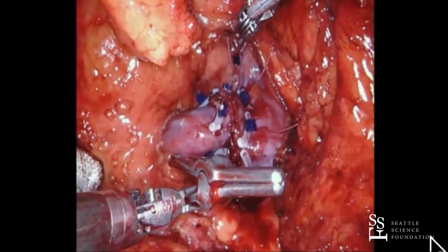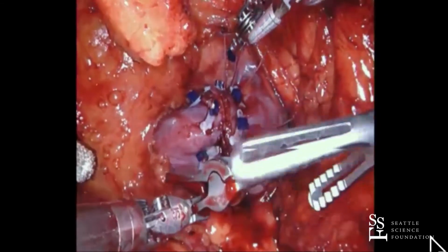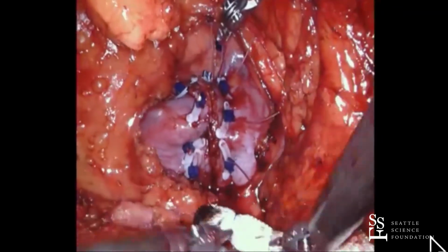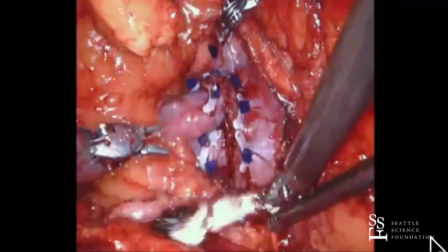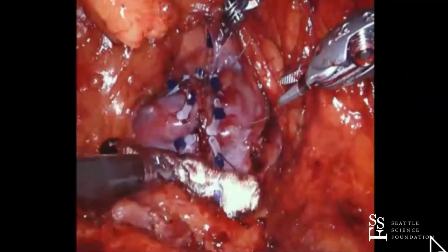I think that's good for research purposes, but honestly, for the guy out there in the trenches doing partials, right now, saving an extra 1% of kidney versus cranking down and making sure it doesn't bleed post-op, I would choose the latter. Right now it looks good, right? There's no bleeding. You give ICG, there's good perfusion. It'll prevent you from wanting to crank down more, right? That's what I'm saying.